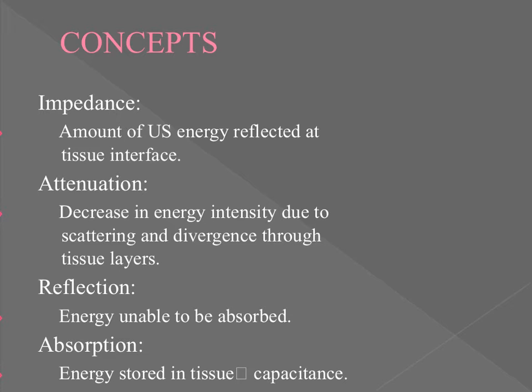In terms of partial reflection, that's going to happen when we're typically ultrasounding over a bony area that exposes the ultrasound head. So most often that's going to be like the olecranon process, the acromion, right? And or any of the lateral or medial malleoli. Because what we know about that is that the ultrasound head isn't making 100% contact with the patient. It's making some contact with the external environment. So we're going to get partial reflection. If I define it in layman's terms, it would be energy that is unable to be absorbed. And that can be a good thing or a bad thing, again, depending on the goal of the treatment.